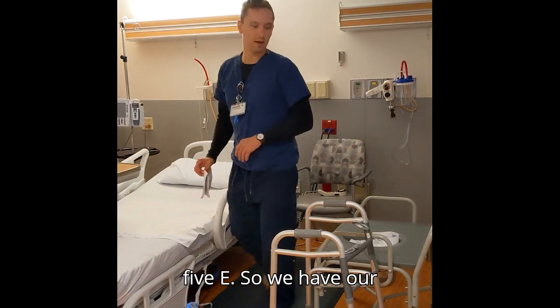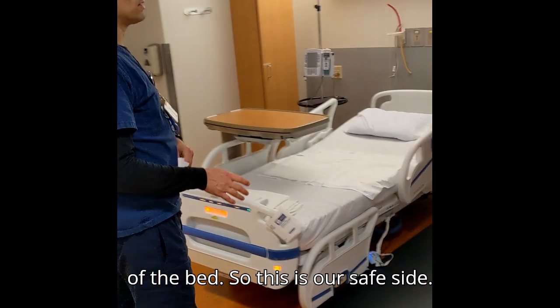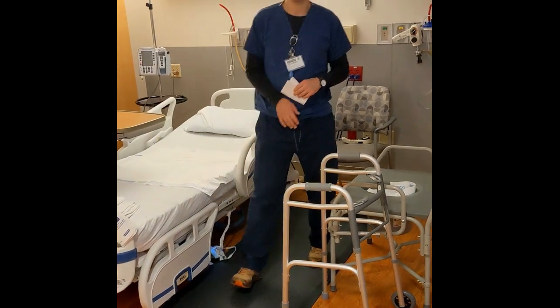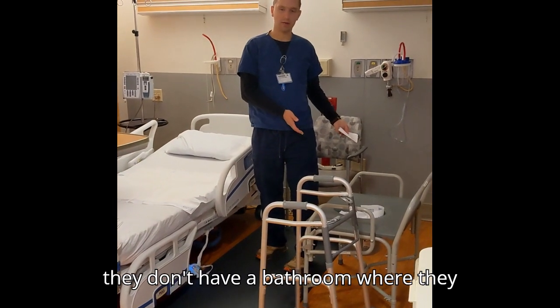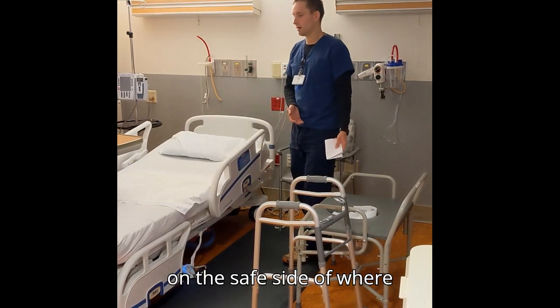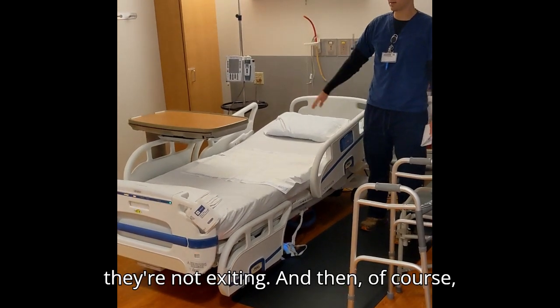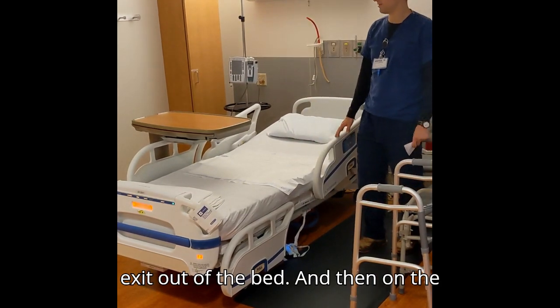So we have our safe side of the bed and our working side of the bed. This is our safe side. This is the side that the patient should be getting out of. It should be ideally the side closest to the bathroom, because it's the shortest distance. If they don't have a bathroom or they need a commode, we can set the commode on the safe side where they'll be getting out. We have our side rails up on the side they're not exiting, and then of course the side rail down so that they can easily exit out of the bed.